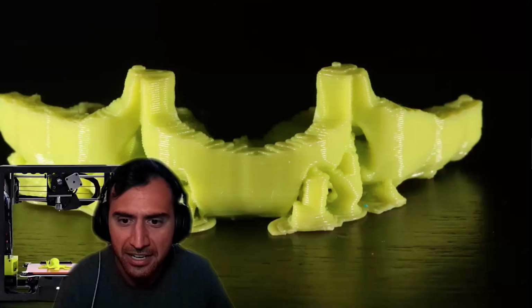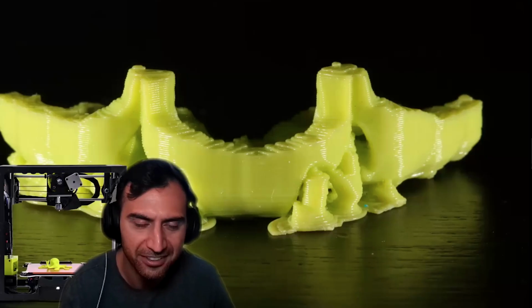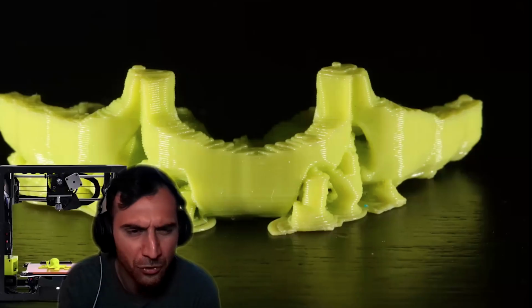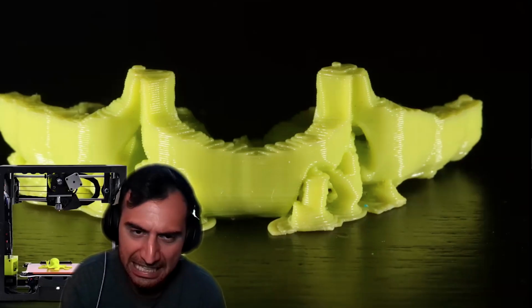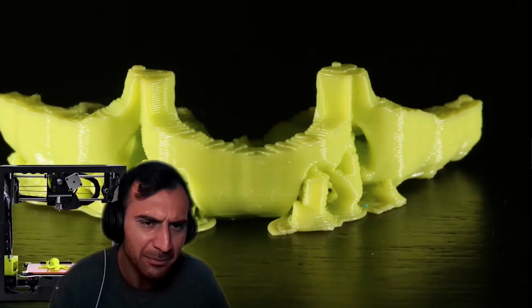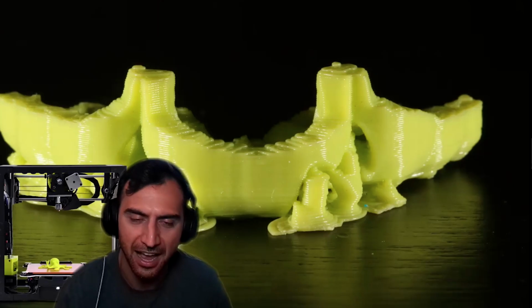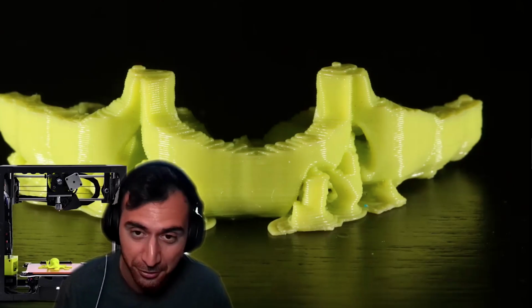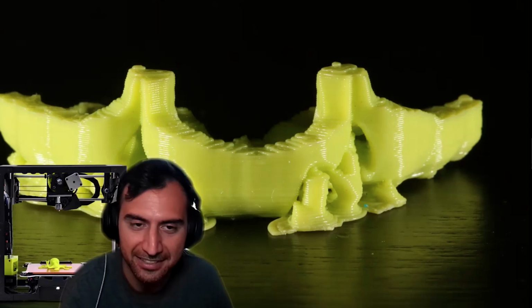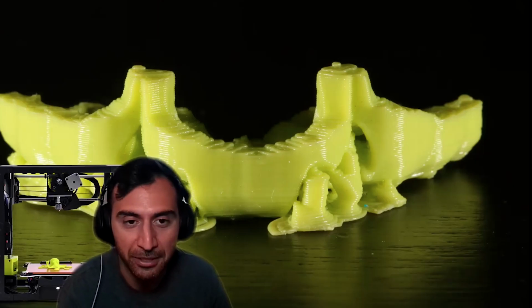These were great. I mean, these were great. A lot of things that were printed with them didn't have as great of a resolution. You would notice layering in the object. You'd notice the layers that it would print up. And it was stringy, and it could distort pretty easily. It's heat made, so heat applied to it again can distort it. So it had limitations. The main thing I was using it for was printing anatomical structures. I did print my very first ever surgical guide with that material, though, because the resin printers didn't really exist at that stage. And so most of my very first surgical cases were actually with these filament printers.